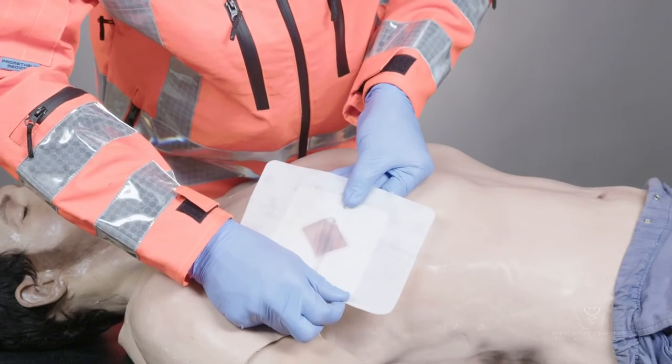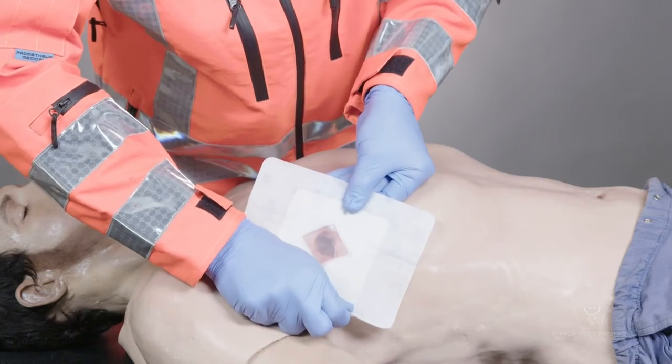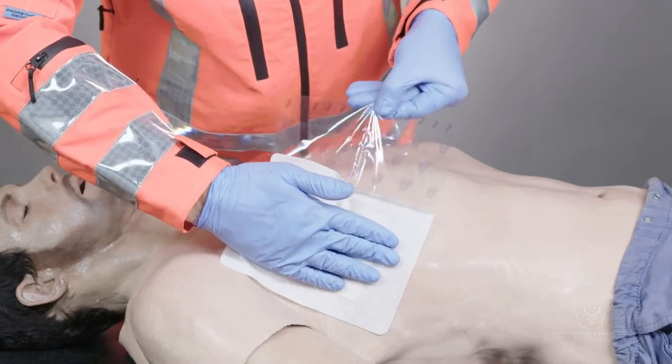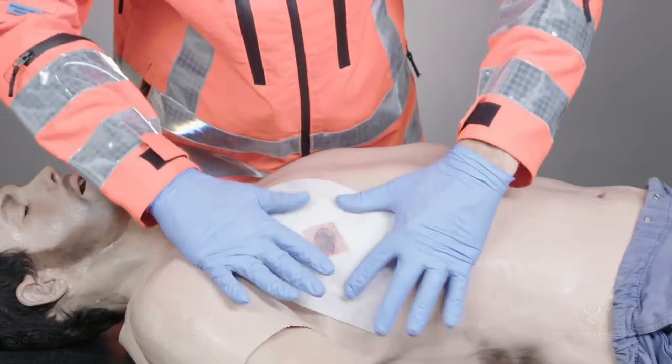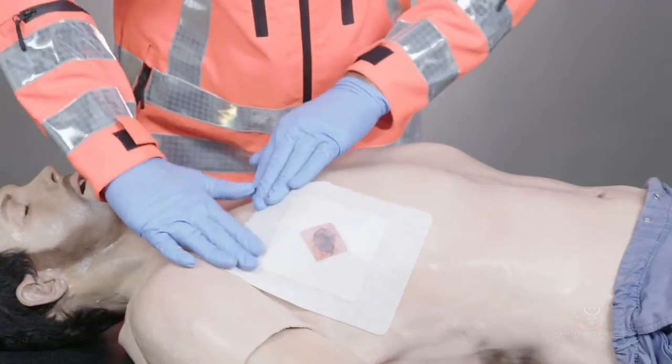Once aligned, place the exposed adhesive surface onto the patient. You can now remove the second liner and gently firm down across the dressing's adhesive area to ensure that it is properly attached. Ensure that the valve is not obstructed as this may reduce its ability to function properly.